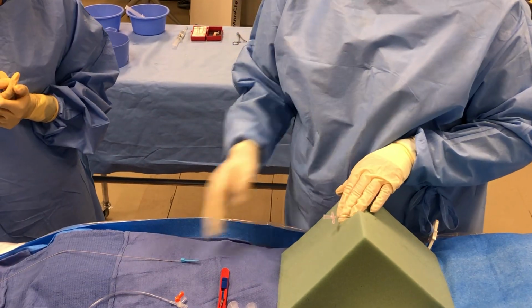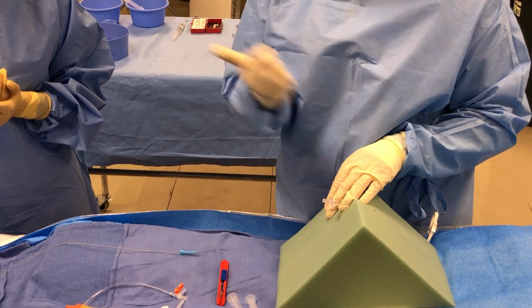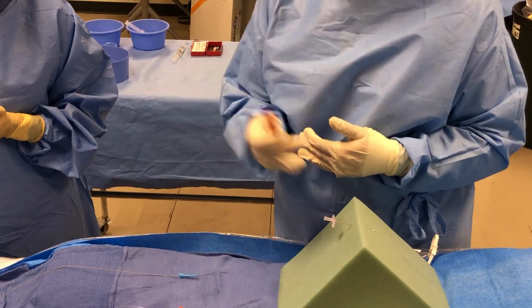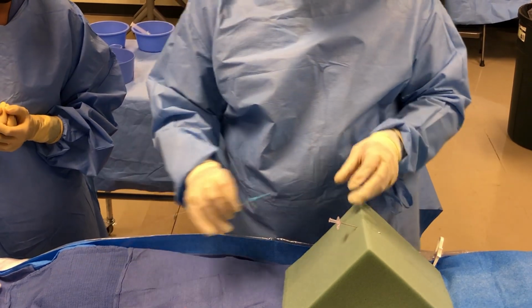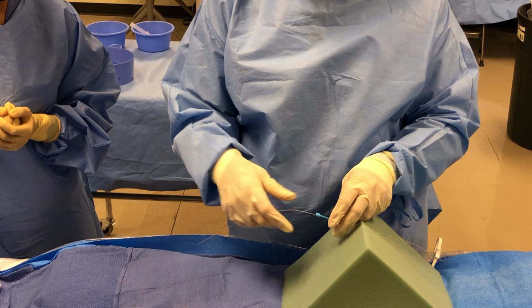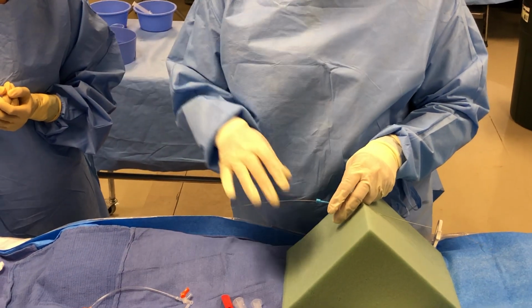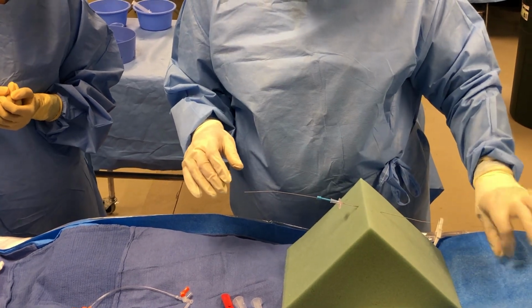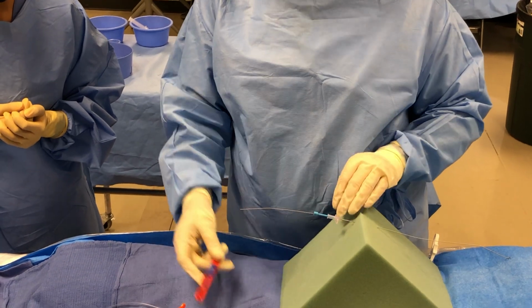At this point, before we put our wire in, blood is spurting out. You sit here and there's no need. Blood's just still spurting out. Every heartbeat, blood's gonna be spurting out. So once you put this wire in, it stops that blood. It closes that lumen up. Blood's not gonna be spurting out anymore, okay? The wire's going down into the artery. Make the nick in the skin here, or once we've removed the needle.